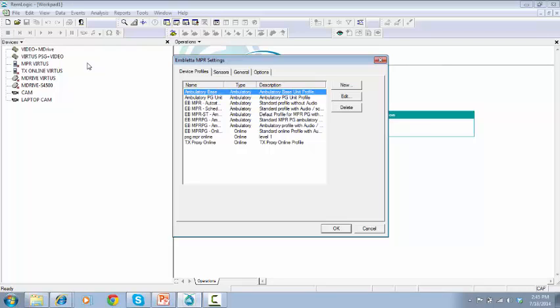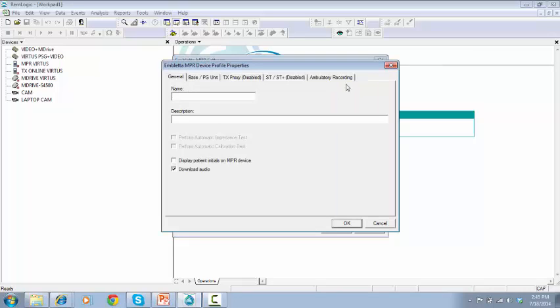Embletta MPR Settings window will pop up. On the right top corner, click on New. Device Profile Properties window will pop up. Work through each single tab. On tab General, type name for this profile.